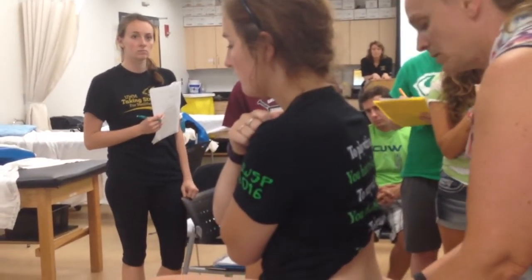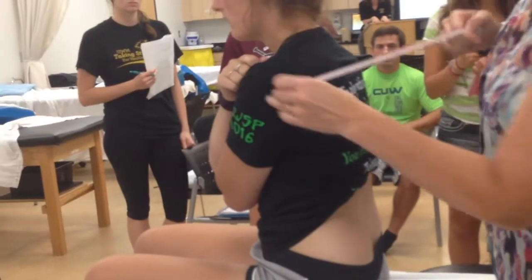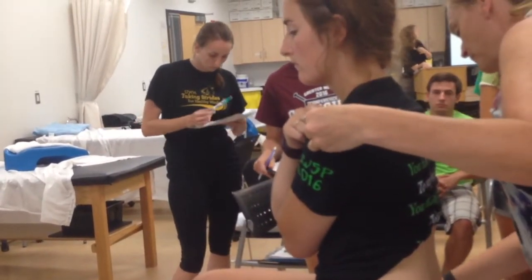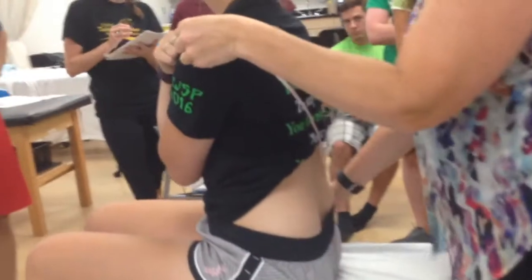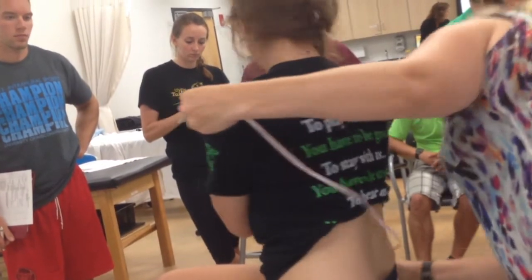The tape measure approach for rotation is going to be the greater trochanter again, and then the lateral acromion. I'm actually going to have you turn to your right. My starting position is 68 on the dot — go ahead and turn to the right. And come on back. Now she's at 74.9. So I would subtract those and document the difference.